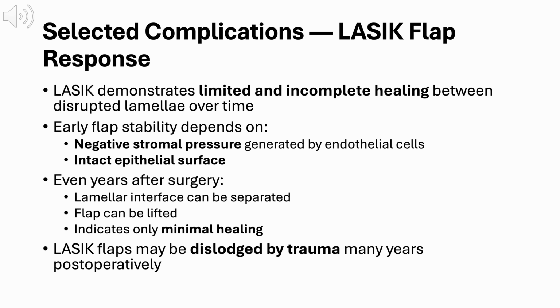LASIK flap healing is intentionally limited, and that has important clinical implications. Unlike surface ablation, LASIK shows incomplete healing between disrupted stroma lamellae over time. Early flap stability does not depend on scar formation. Instead, it relies primarily on negative stromal pressure generated by endothelial pump function and an intact epithelial surface sealing the flap. This limited biological healing persists long-term.